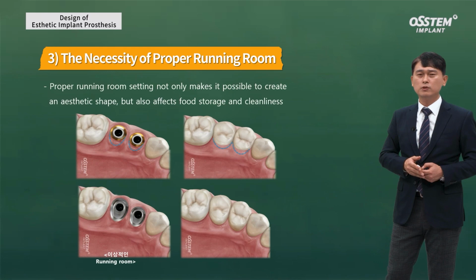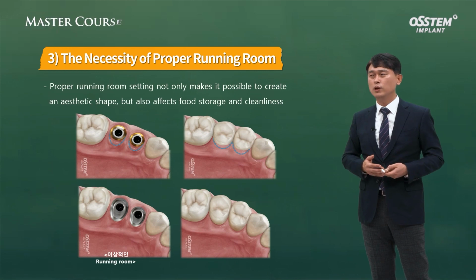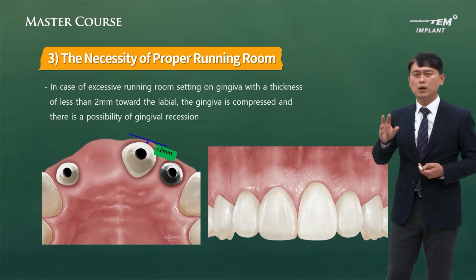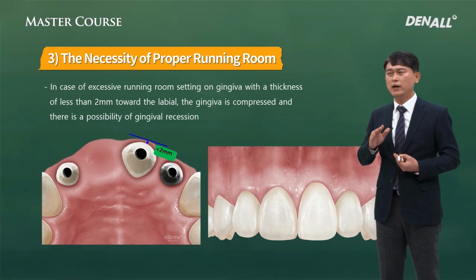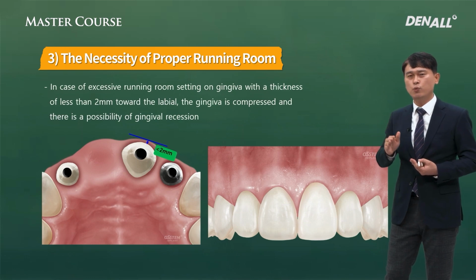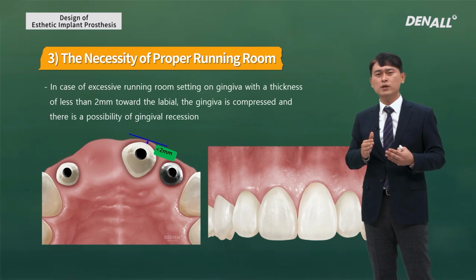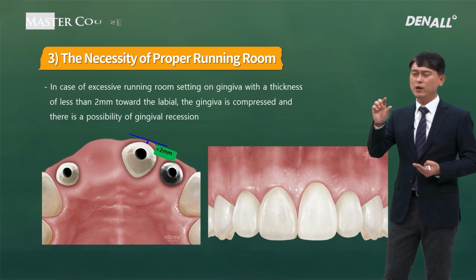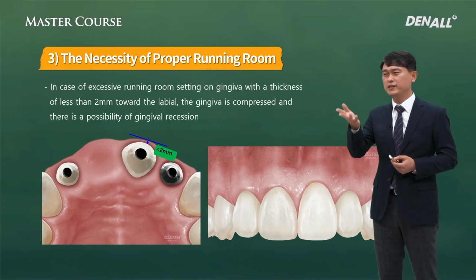We pay a lot of attention to this in our prosthodontic department. When we make custom abutments, we give similar size and shape of natural teeth. Keep talking about that. 2 millimeters of soft tissue on the buccal side, and if you do proper molding, gingival recession can be prevented. If it is less than 2 millimeters, gingival recession can occur easily on the thin biotype. Its side effects would be hard to manage. That will lead to a war with your patient, so you need to be careful. To prevent this from the beginning, especially for thin biotype, we need to pay attention to this quite a lot.